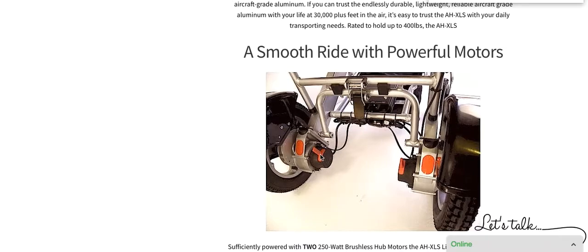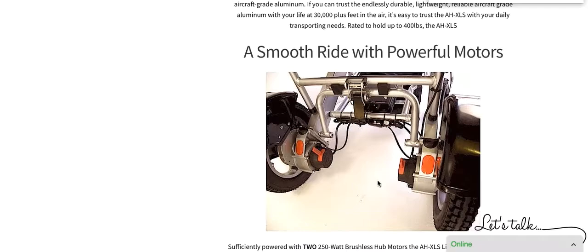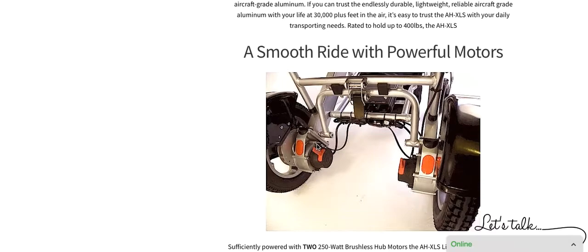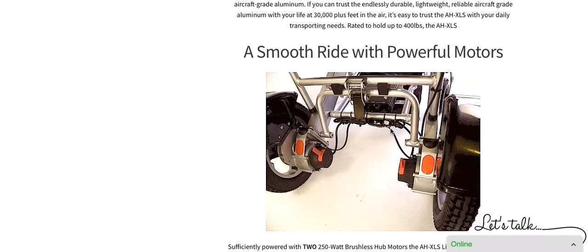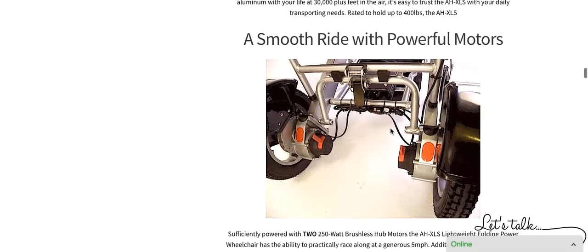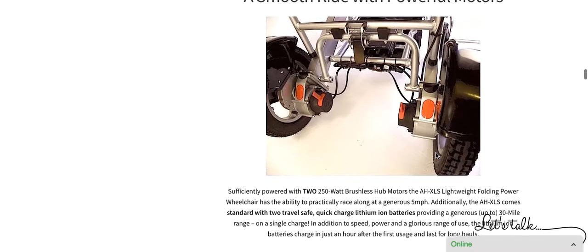You can see that each lever right on either side of either side of the motor will allow the chair to be very easily converted into a manual push chair. Just by simply clicking the lever forward, it engages the gear, or by clicking the lever back, it allows it to become a manual push chair. And you can see right here how the chair actually latches open. It is such a simple chair to open, such a simple chair to close, and so easy to make an actual manual push chair.